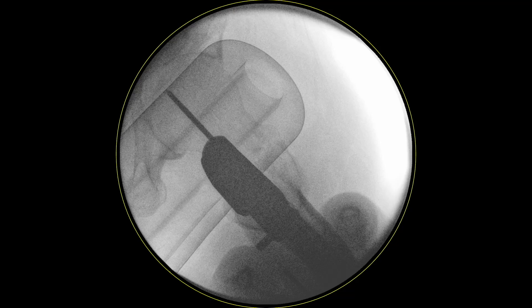Hello friends. Some viewers have reported that when placing cephalomedullary nails like PFNA2 or TFNA, they face a problem where after nail insertion, the screw or guide wire tends to go either posteriorly or anteriorly. That means the entry of the guide wire is located more posterior or anterior. At this position, if they try to rotate the nail or the zig, it causes mal-reduction and the fracture reduction is lost.